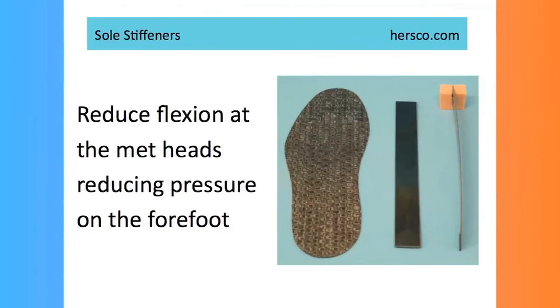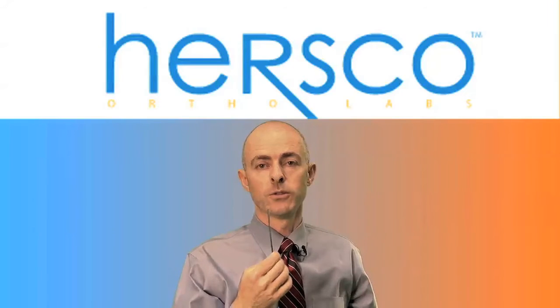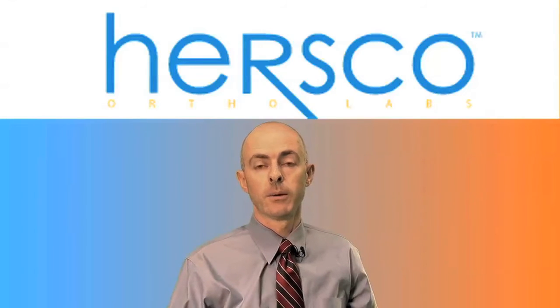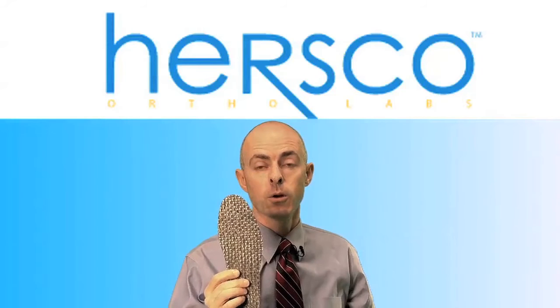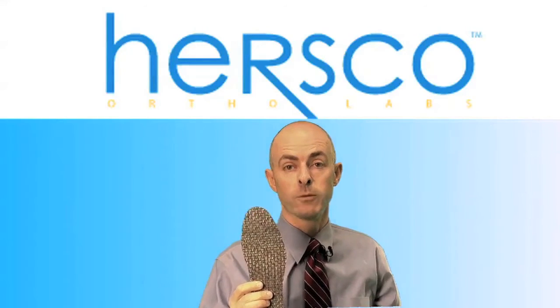In cases where you're trying to prevent flexion, you can also use sole stiffeners which can be added to the midsole of the shoe. In the olden days, they used to use steel spring. This was added to the midsole of the shoe and then the outsole was layered back on top. Nowadays, it's possible to use thinner and lightweight carbon graphite materials, and these can be added either to the midsole of the shoe or also just placed inside the shoe underneath the sock liner or the insole itself.